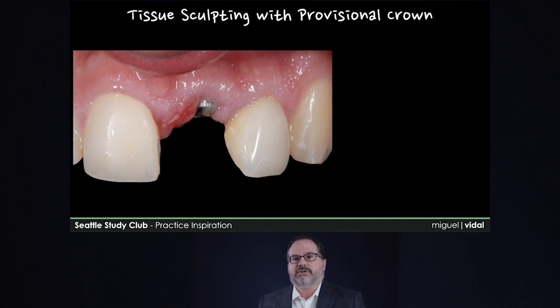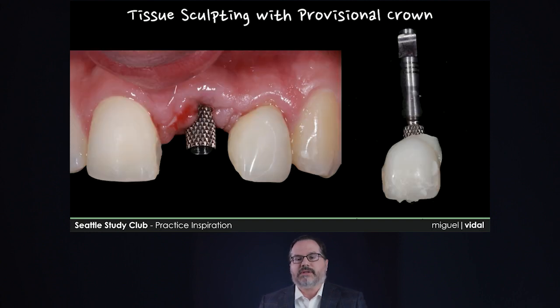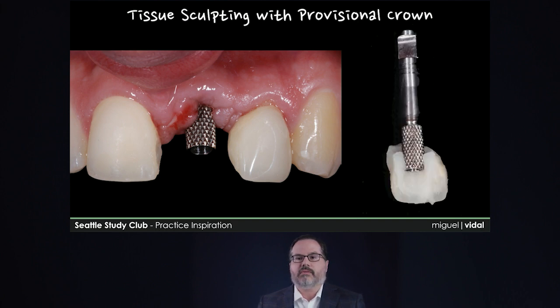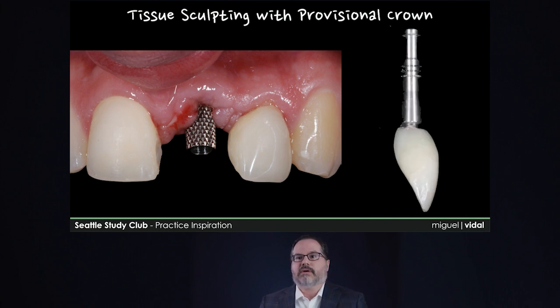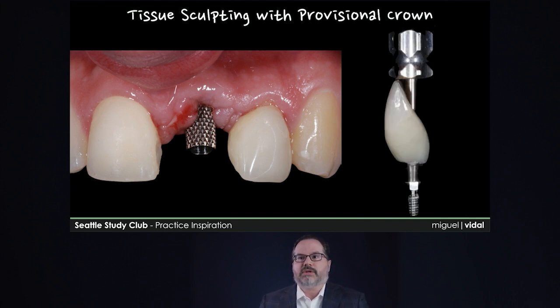So going back to our clinical situation, we're going to go ahead and place our temporary abutment and use the patient's own provisional and hollow grind it and pick it up intraorally with restorative material. And you can see here from a lingual view the amount of material that we need to flow subgingivally to really create the contours for this crown, as you're going to see here, and a properly placed and screw-retained implant provisional.